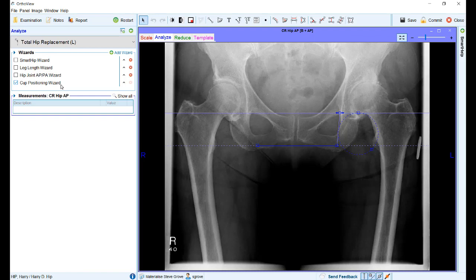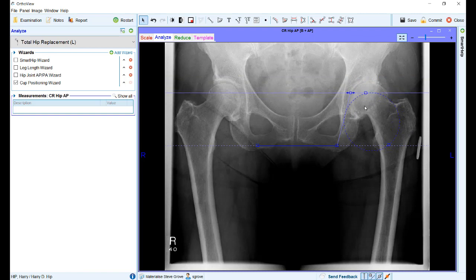The new cup positioning wizard allows marking of anatomical landmarks and provides an additional optional positioning choice for the acetabular cup at the templating stage. The wizard allows marking of the teardrops, the medial wall of the acetabular, and the outline of the acetabular socket.